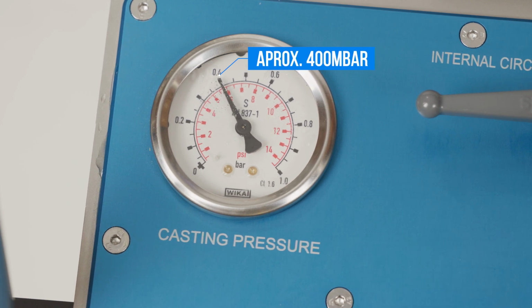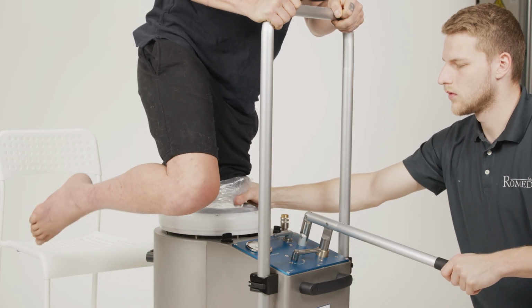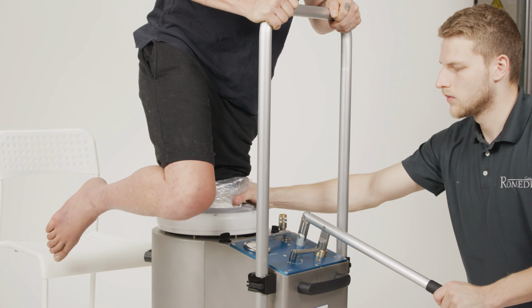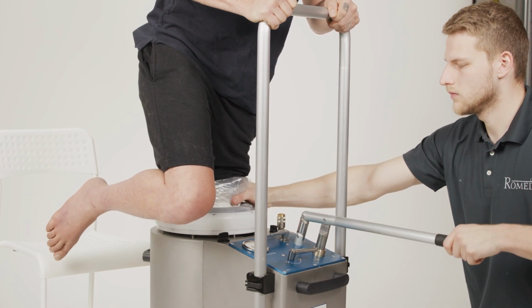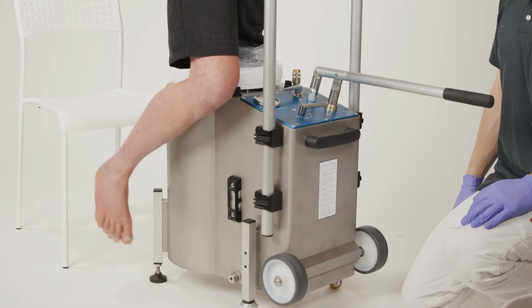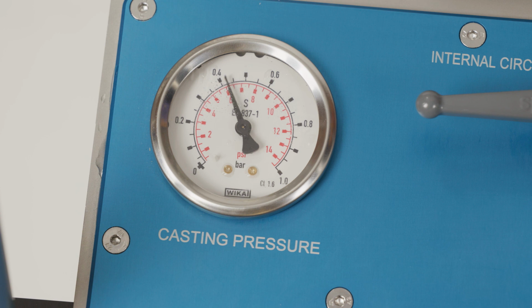As of approximately 400 millibar, be sure that the patient's residual limb now statically bears the load completely, or as well as possible. Increase the pressure until you reach the calculated pressure. During the impression process, pressure should be kept constant. Depending on the type of the plaster dressings applied, the standard setting time is spent in a completely burdened and static state. After the plaster dressing has hardened, set the levers to internal circuit and empty.